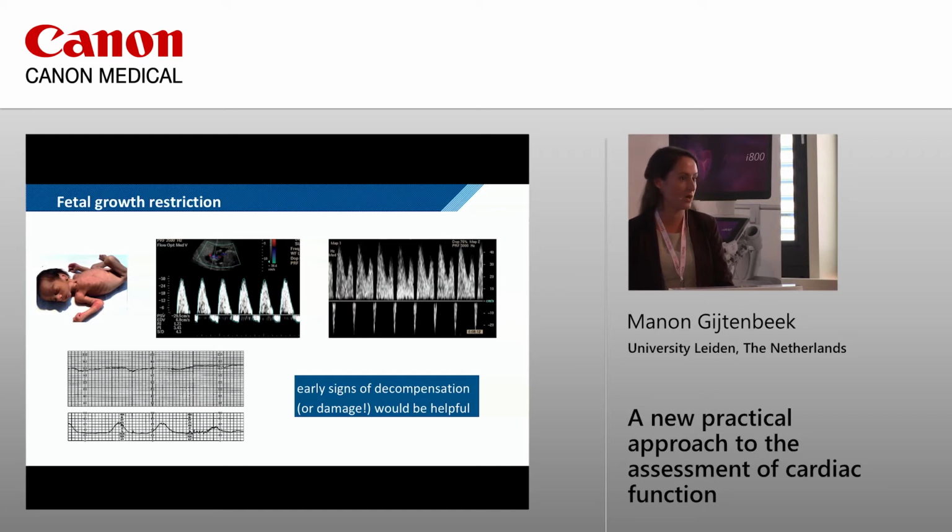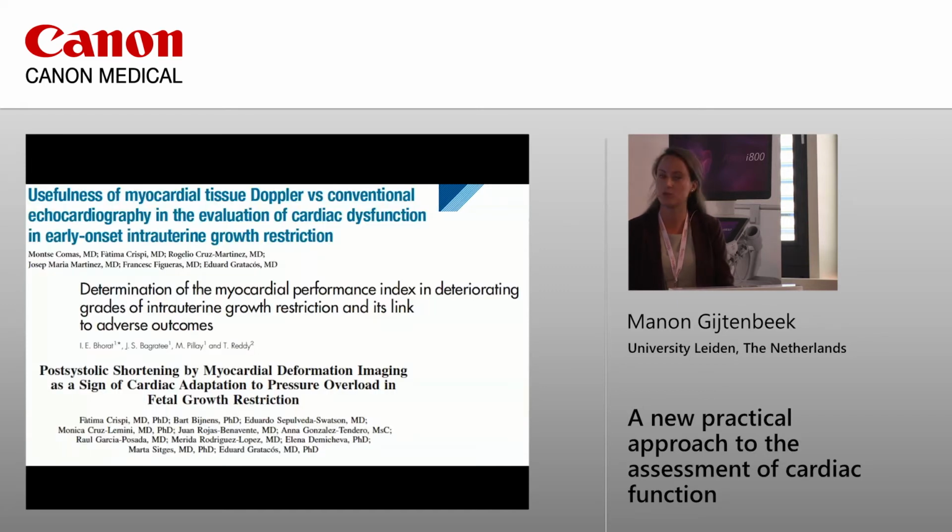So over the years, there have been several studies investigating the use of cardiac function tools to assess fetal cardiac function and the fetal condition. Especially the MPI, the Myocardial Performance Index, has been the topic of studies over the last years. This is a technique that gives evaluation of both systolic and diastolic cardiac function. However, this is a technique which is fairly difficult, in my opinion, and it's not easily implemented into daily practice.